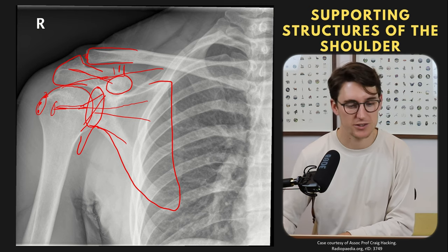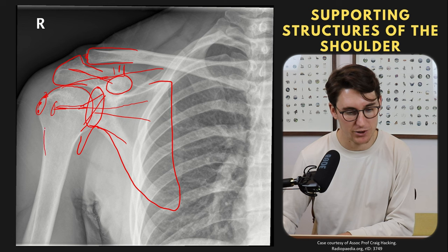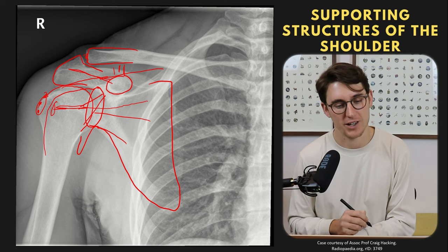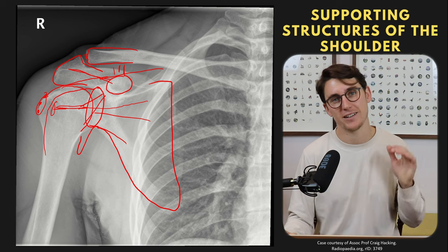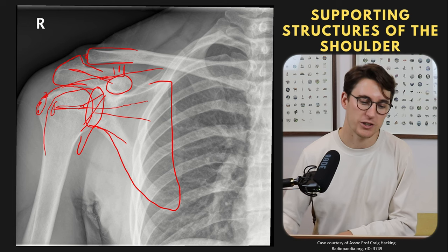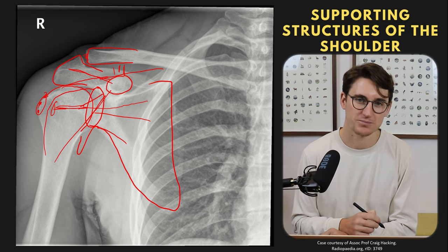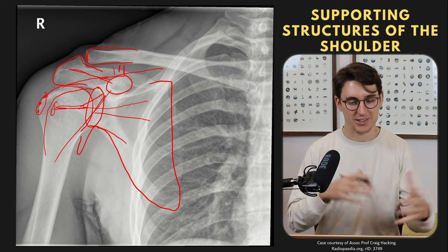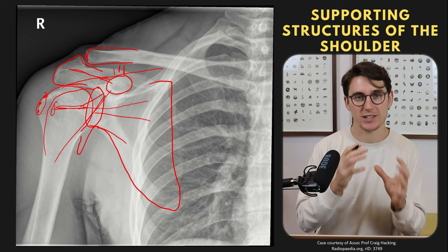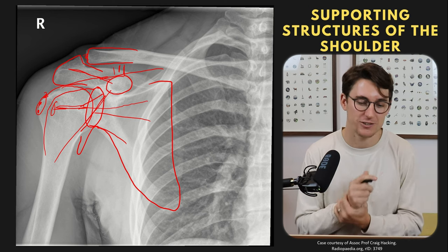In between the greater and lesser tuberosities is the intertubercular or bicipital groove. The long head of the biceps tendon runs through this groove and attaches to the biceps anchor on the superior labrum — it's the only tendon in the body that is actually intracapsular, running through the capsule of the glenohumeral joint. The short head attaches to the coracoid process. You really need a good understanding of where all these components lie relative to one another to identify them on a single MRI slice.